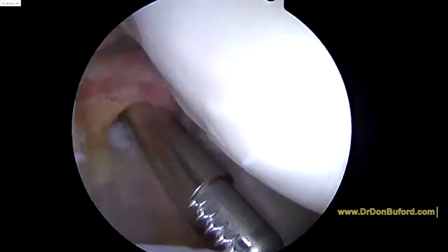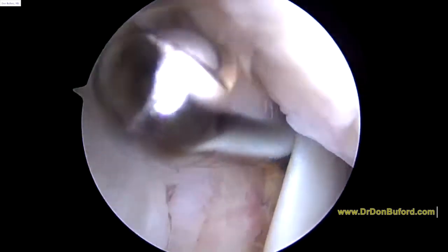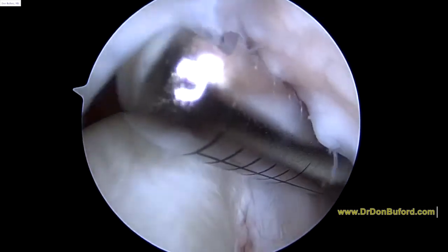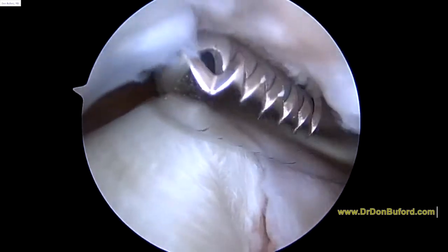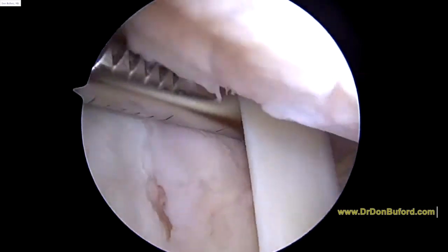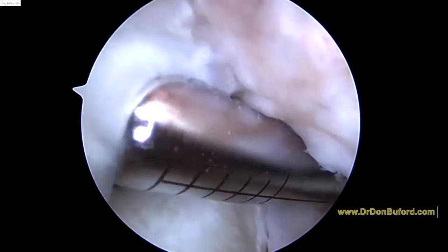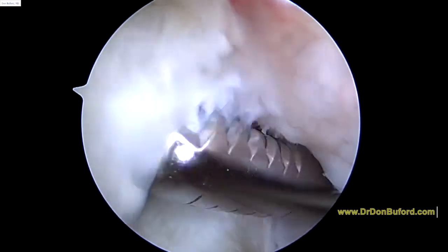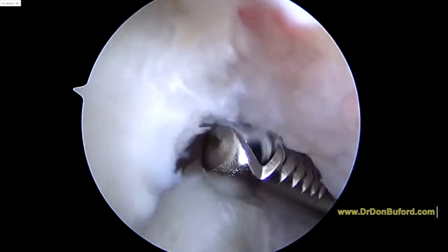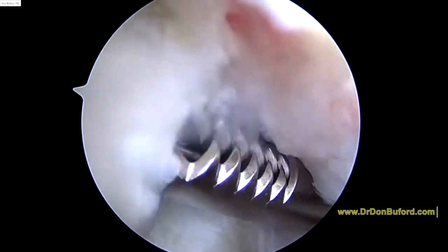We're going to rotate and look at the rotator cuff tear, which is right here. This is the hole in the tendon right there — that's what the ultrasound showed us. Remember, we didn't get an MRI scan, we only had the ultrasound, but our sensitivity and specificity with that is well over 90%, just like an MRI scan. So I'm glad we didn't have to burn a couple days to get an MRI scan and then come back to the office for a diagnosis.